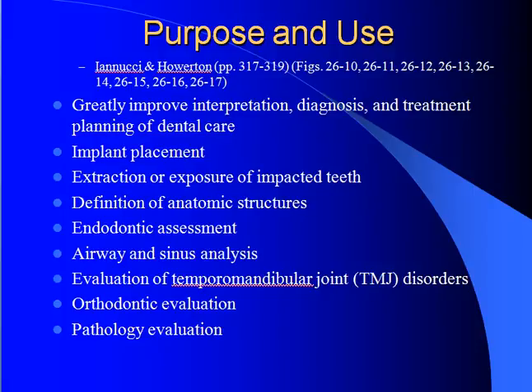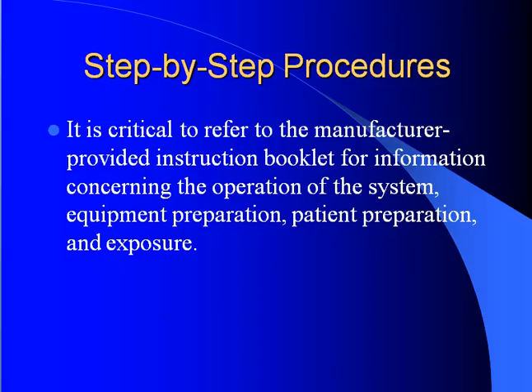Comprehensive examination and interpretation of images should be completed and documented with the overall health of the patient in mind. It is critical to refer to the manufacturer-provided instruction booklet for information concerning the operation of the system, equipment preparation, patient preparation, and exposure.